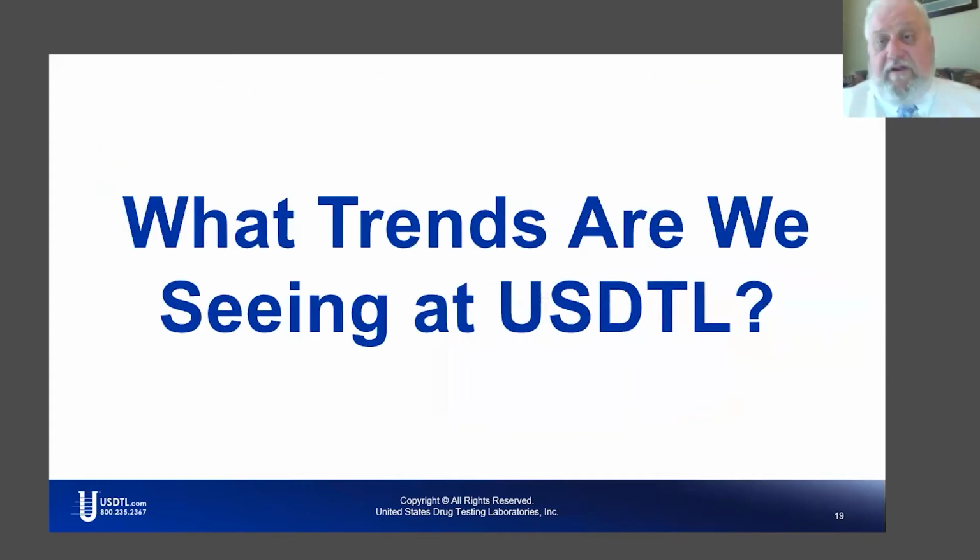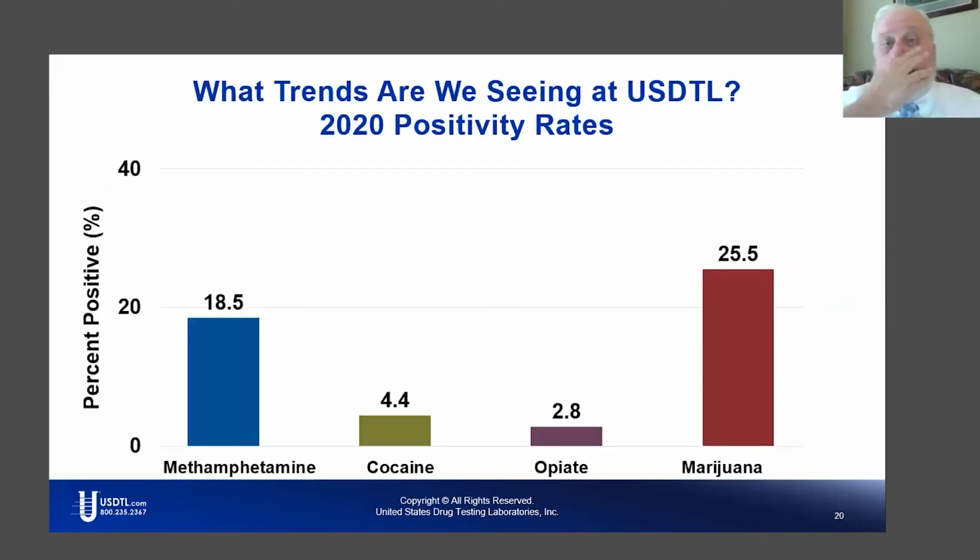So what do we see with our fingernails here at USDTL? If you were at our last ToxTime, we talked about child guard hair, and the positivity rates were crazy high, like 80% or 70% for the methamphetamine. We've seen this big increase over the last 5 to 7 years, and we're seeing that across the board. I was just recently attending the College on the Problems of Drug Dependency conference this week, and this was a big part of the discussion as well: this next wave, the stimulants, is coming back. So be ready.